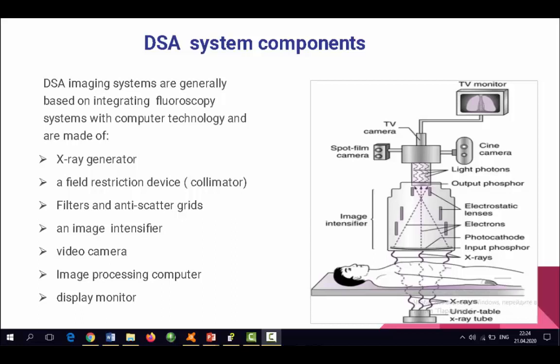Fluoroscopy is an X-ray imaging modality in which the images produced appear in real time, and this allows evaluation of dynamic biological processes. Electronic fluoroscopy creates this perception of X-ray video by capturing and displaying images at a high frame rate, typically 25 or 30 frames per second. At this frame rate, the human visual system cannot distinguish frame-to-frame variation, and motion appears to be continuous.